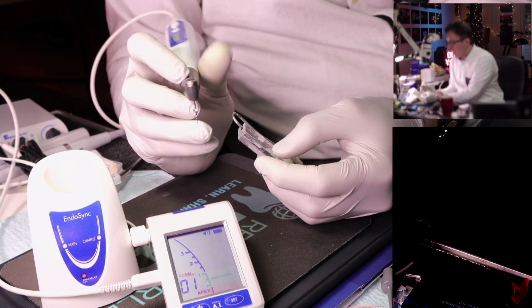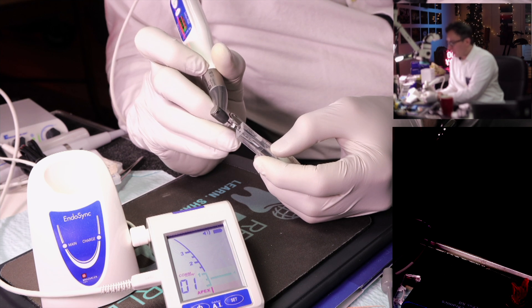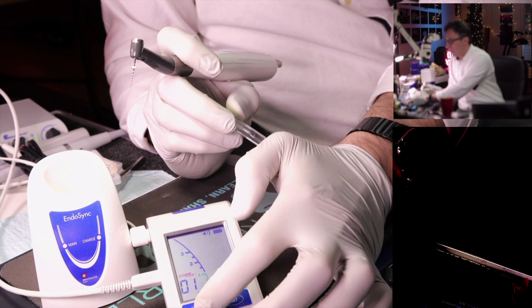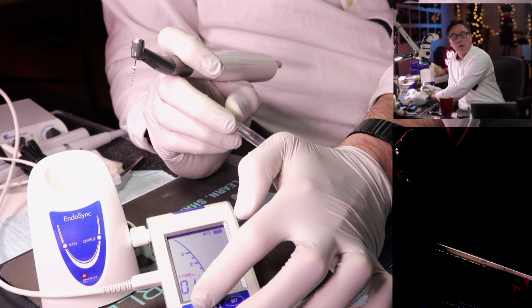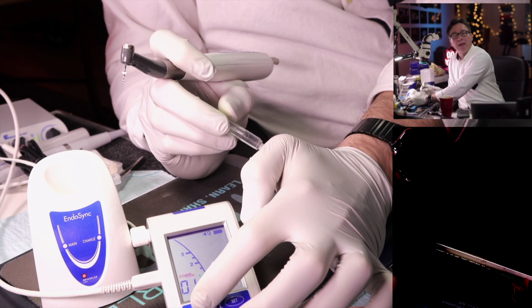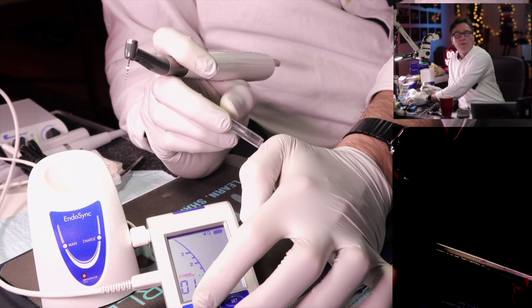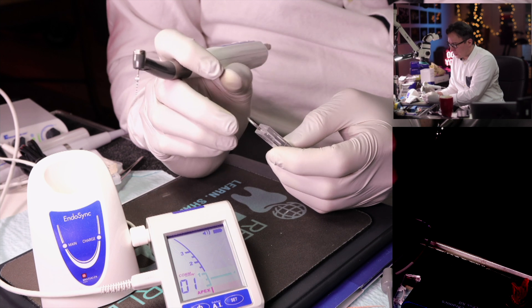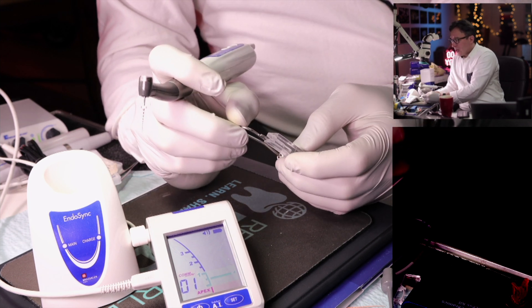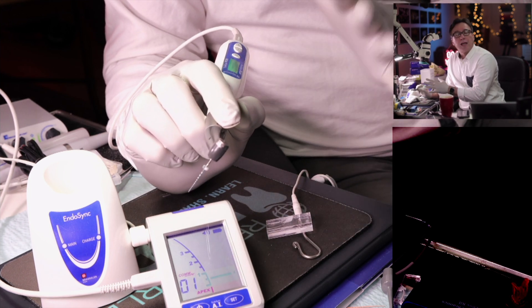The workaround I use clinically is having the assistant keep the apex locator nearby. They turn it off, which allows me to reactivate the file and bring it back out, then they turn it back on. They usually count to three or five before turning it back on so they can remeasure. You can also change the apical action setting in the program menu.